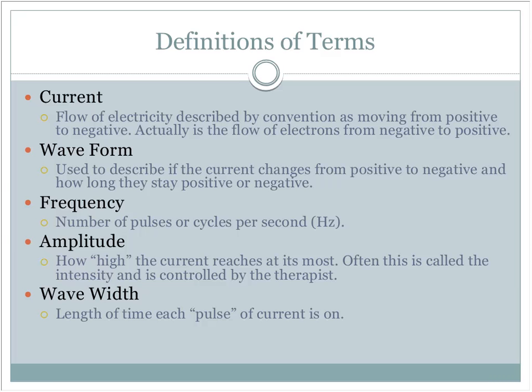So the first thing we need to talk about is current. And I did mention current before, because sometimes the patient is involved in the current, and sometimes they're not. But current basically is a flow of electricity. We describe it by convention as moving from positive to negative.